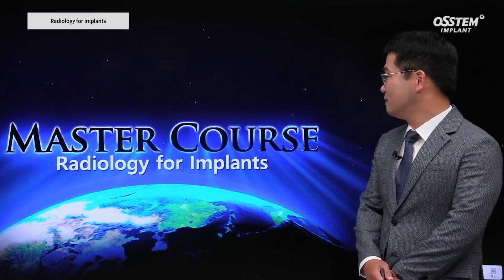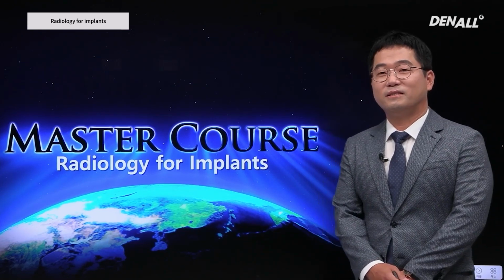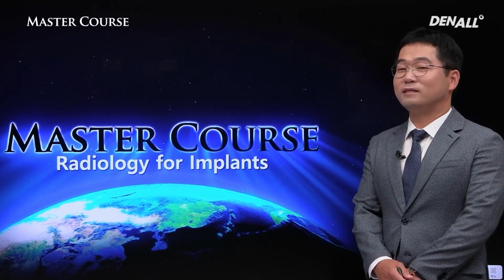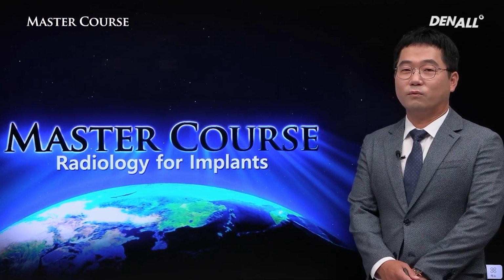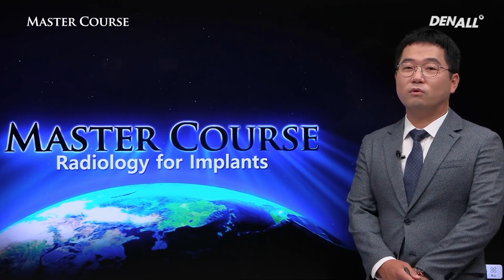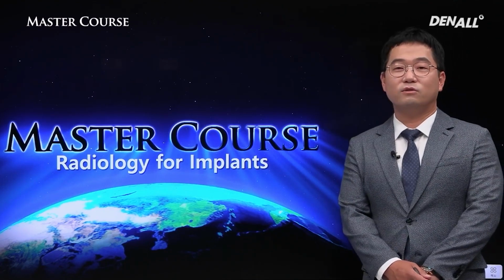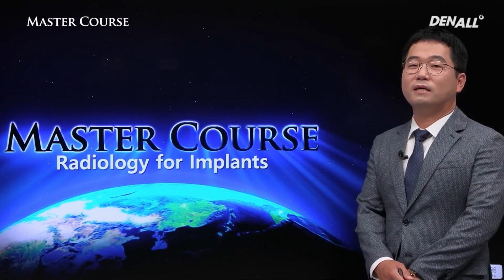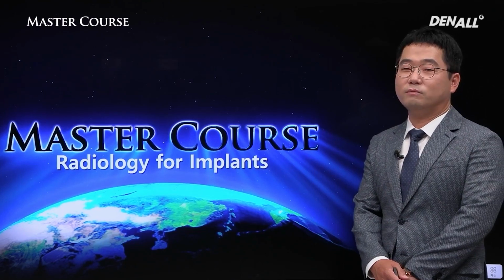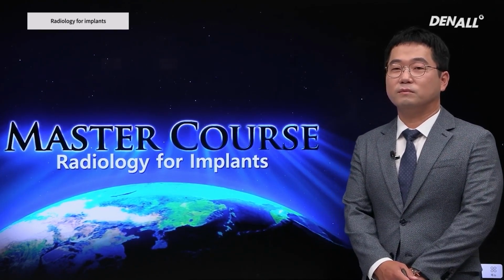Today I'm going to talk about radiology for implants in the online master course. When I provide offline lectures, it can be quite boring for many students, because many people know about it. This has been well known for a long period. Many people find it tedious and a bit boring, but this is something we must know.